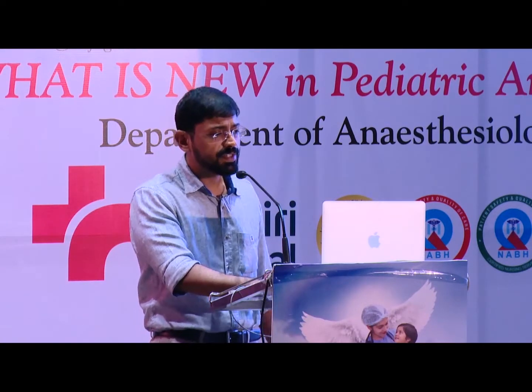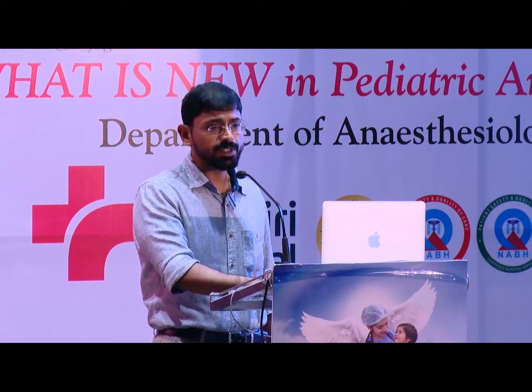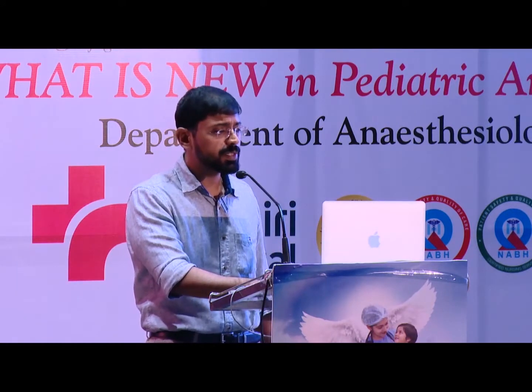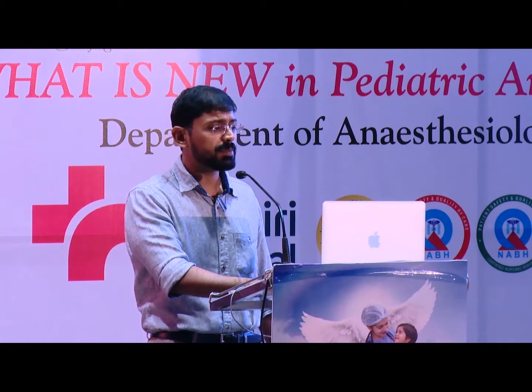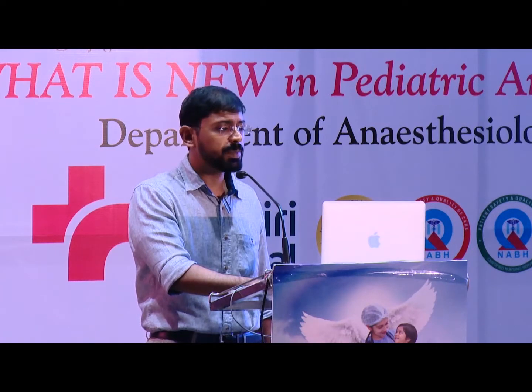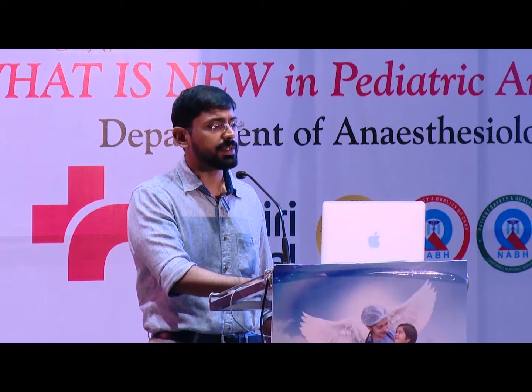So generally, indications for high frequency, you could use it for any baby. It is used as a rescue option for any case of severe respiratory acidosis. It can be used in HMD, it can be used for pneumothorax, it is used in cases of pulmonary hypoplasia, it's used for pulmonary hypertension, and for babies with congenital diaphragmatic hernia, along with inhaled nitric oxide.